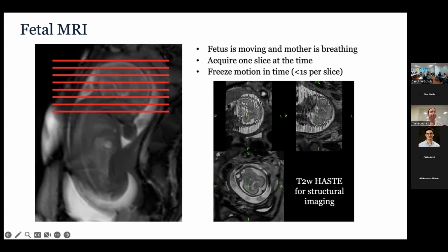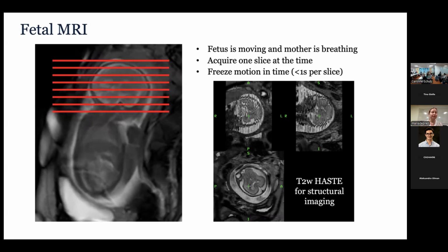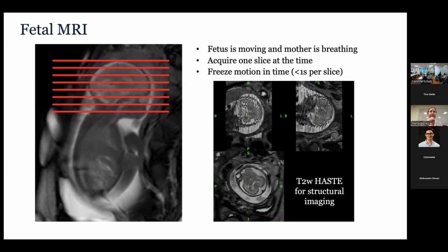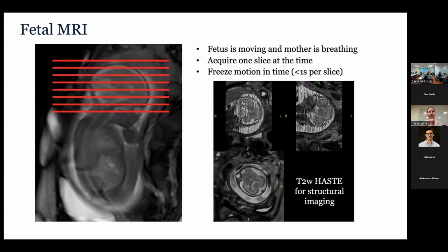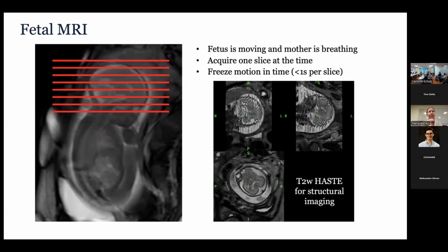What's your standard resolution that you run? Well, it depends on the project, but in plane would be 1.25 and through plane 2.5 is like the most common. But on Siemens, I think now that we've switched, we might have 3 sometimes. Or on a low field scan, we would go to 4.5 even through plane. So it depends on the scan, on the project, how much time you have.